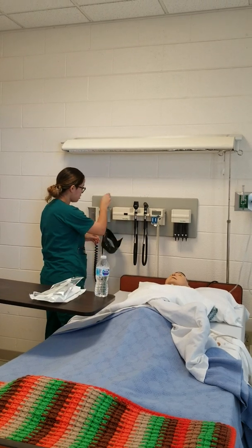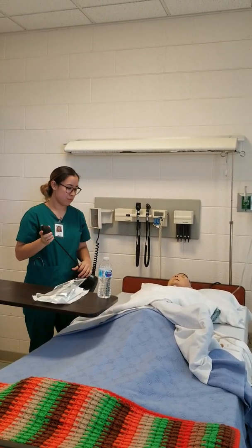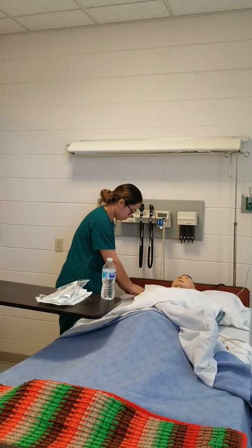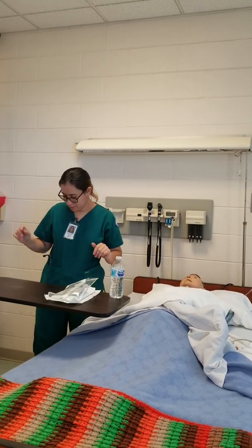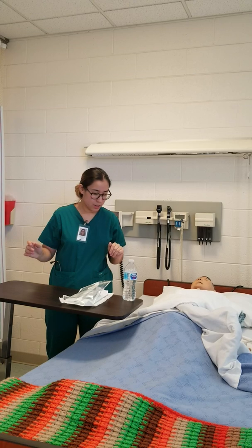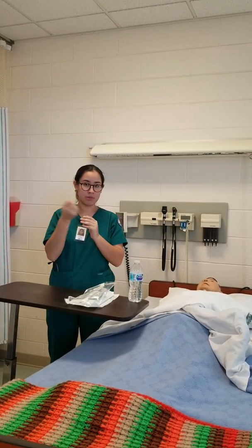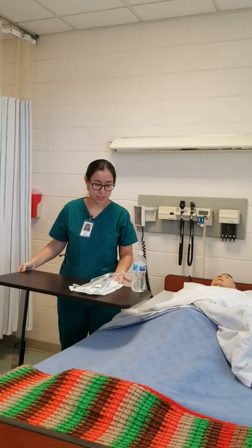I'm going to lay a towel across his chest so I won't get him dirty when I suction. This oxygen will be used to oxygenate my patient. I'm going to turn the suction on. I would wash my hands, provide for privacy, and get my sterile field ready.